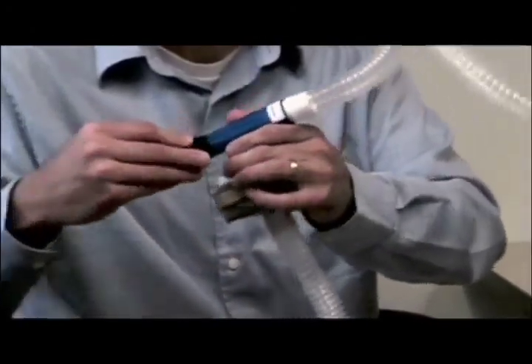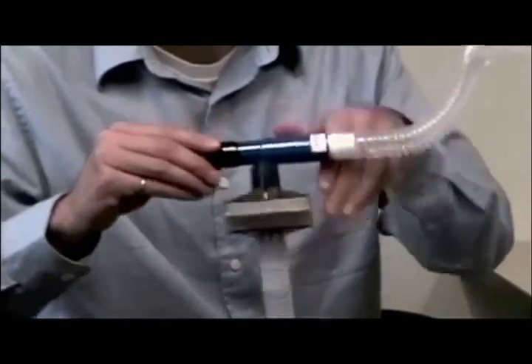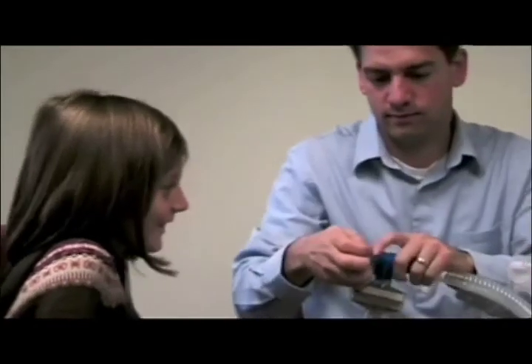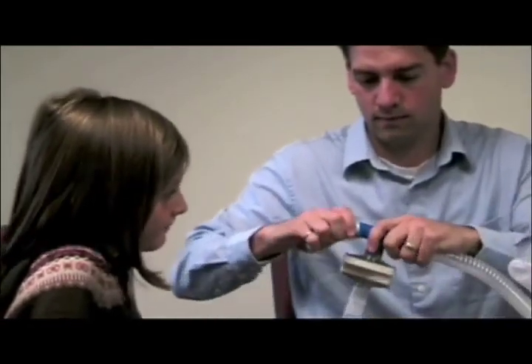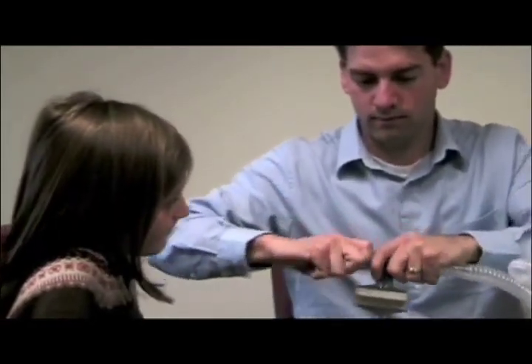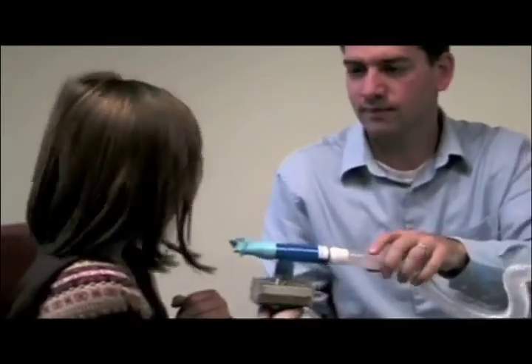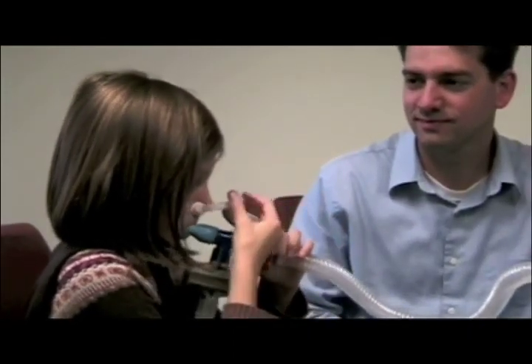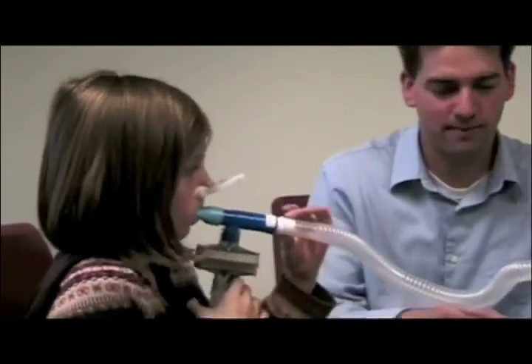The kit also contains a black cap which is put on initially for a short test of the system. After that is complete, the black cap is removed and a mouthpiece is attached. The mouthpiece is made out of a flexible rubber material, similar to one used when snorkeling. The user places the mouthpiece in their mouth and a nose clip on their nose. A quick check that the user can't breathe through their nose shows that the nose clip is working.